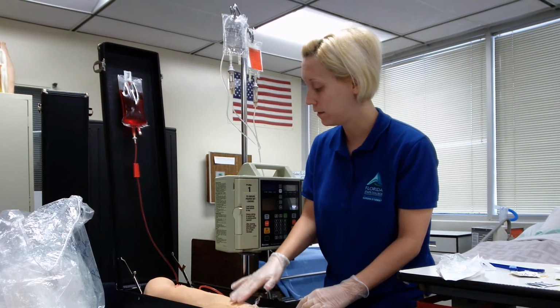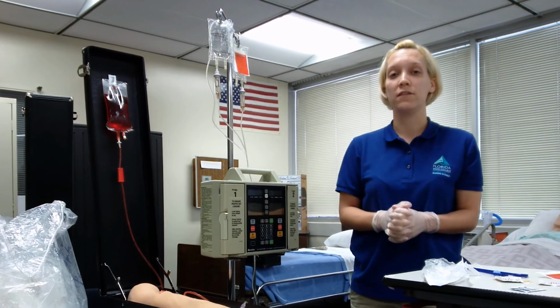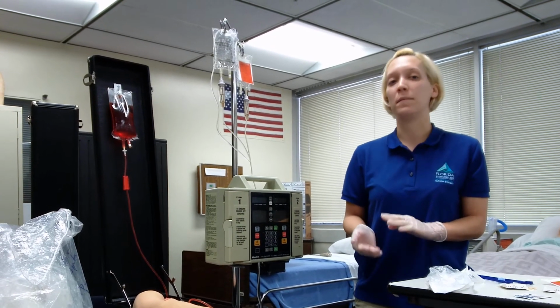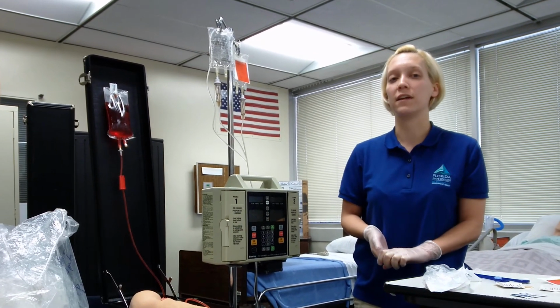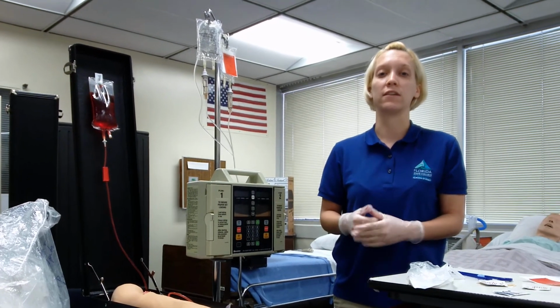How are you doing? Okay, I'm going to document that the infusion has finished. Again, the drug dose, route, any complications, and if they tolerated it. If there were any allergic reactions, I would notify the doctor and document that.